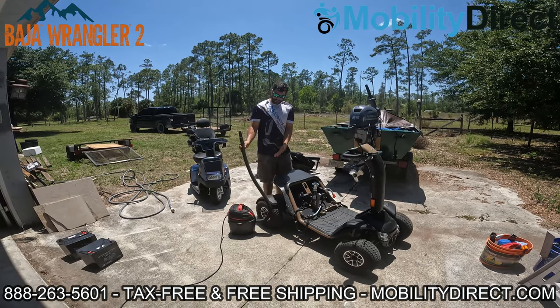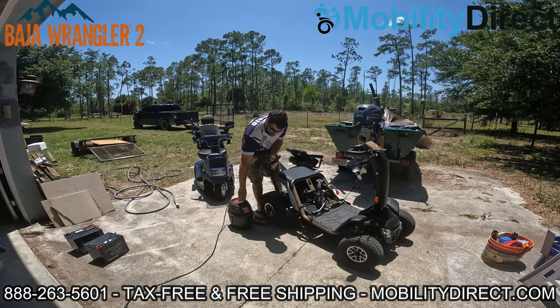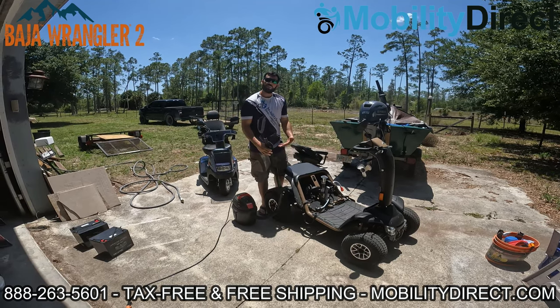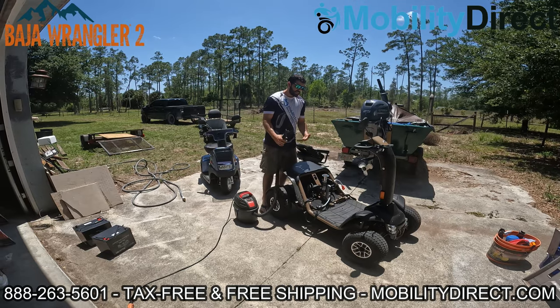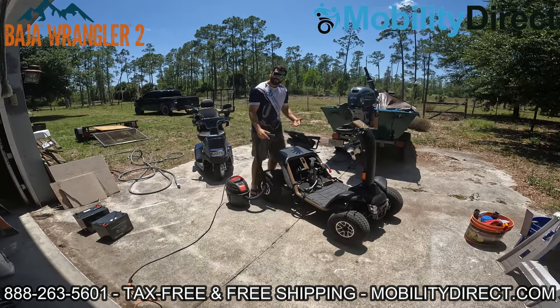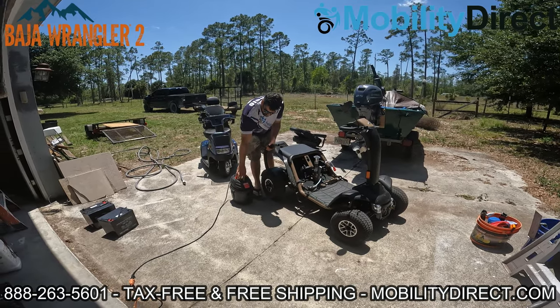Next, we're going to get a shop vac and vacuum out the area before we apply any water, so we can get any dirt, debris, sand, or gravel out of there. You don't want to get the mud wet before you start washing, so let's go ahead and do some vacuuming.